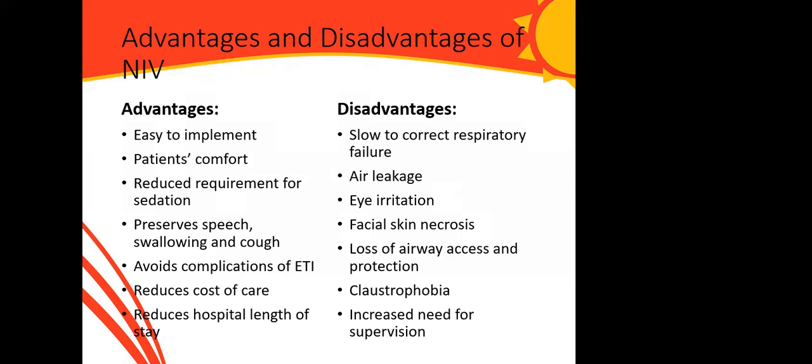It preserves speech, swallowing, and cough, so the patient can do all of this while on non-invasive ventilation. Like I mentioned, it avoids complications associated with endotracheal intubation, which I'm sure you know, and there are many of them. It also leads to reduced cost of care because of the reduced equipment and manpower needed. And studies have shown that it also helps reduce the hospital length of stay.